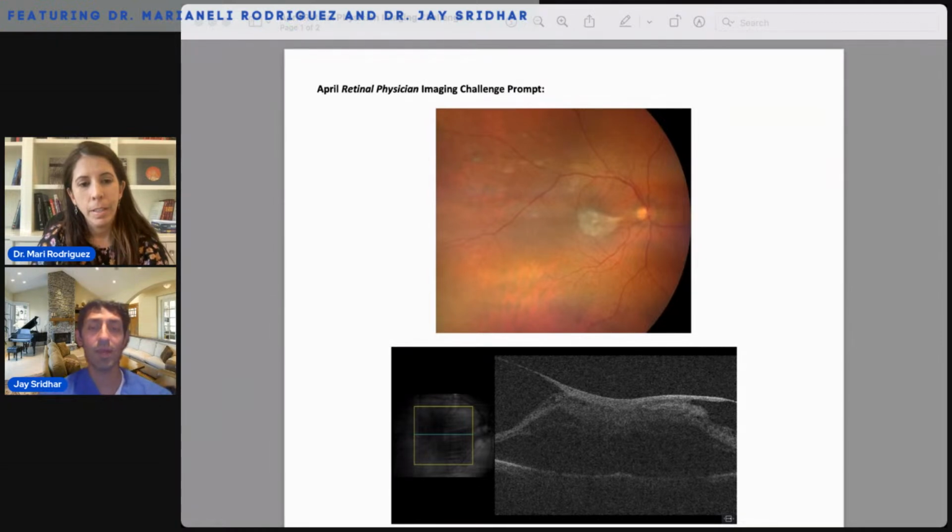So this looks like a case where, in the fundus photo above, you have that whitish plaque-like lesion over the macula involving the fovea, just temporal of the optic nerve. And in the OCT image below, we can see that corresponds to a pretty thick and fibrotic epiretinal membrane that also has a component of vitreomacular traction. The hyaloid is still attached to it. And you can see pretty significant thickening of the fovea with CME. It's hard to tell from here whether there's a component of subretinal fluid too, like a localized tractional detachment. But at the very least, an extremely thickened macula secondary to the traction.